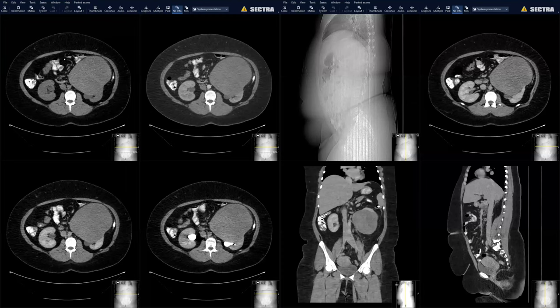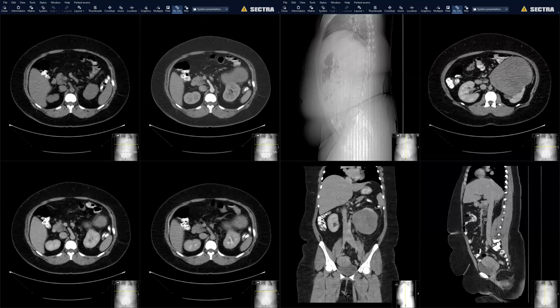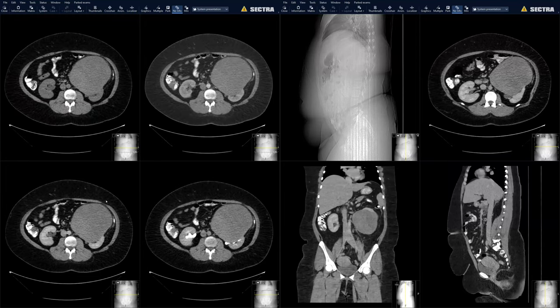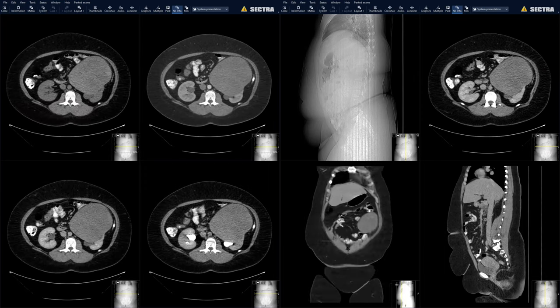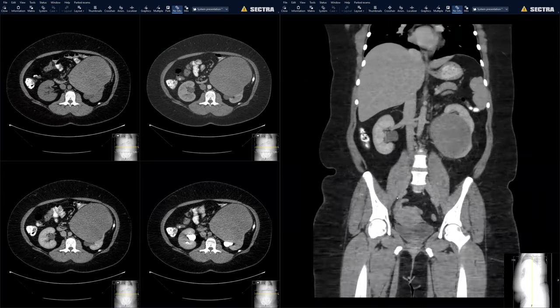Cool. Thank you. I think Kedar said he has one. Yeah, I don't have the diagnosis yet, but I'd like to get everyone's opinion. So I'm going to share my screen. Can you all see my screen? Yes. So this is a 29-year-old woman who presents with abdominal pain, non-contrast, arterial, venous, delayed. And then I have an MR after this. Any thoughts? Can you make it a little bigger? Yeah, sure. Is that better?